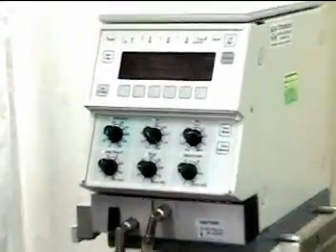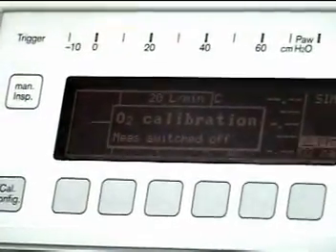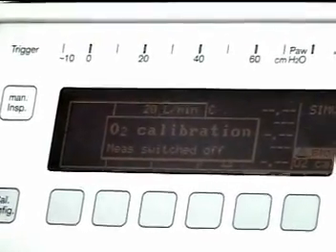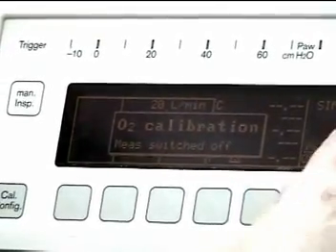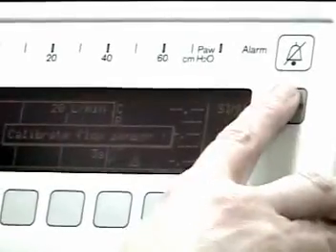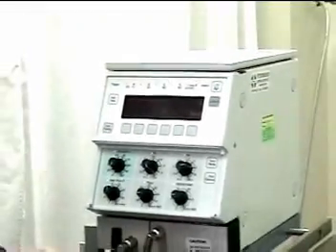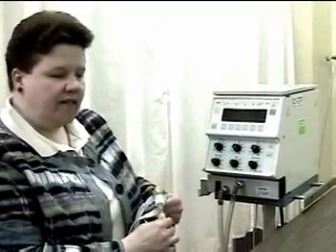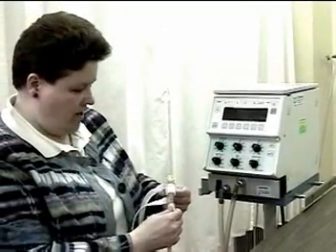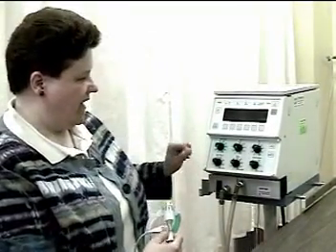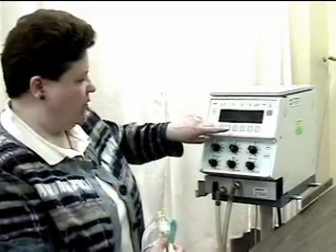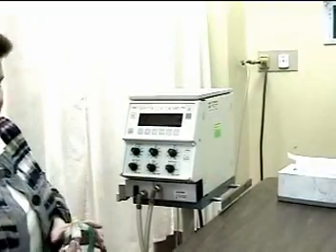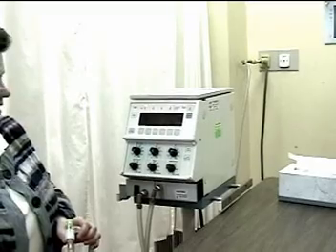At the moment, the ventilator is saying that there's an O2 calibration and that the measured switch is off, and that is correct. We will take this ventilator through all of the different calibrations when we're in the laboratory setting. Initially, what I want to show you is how to set the settings.